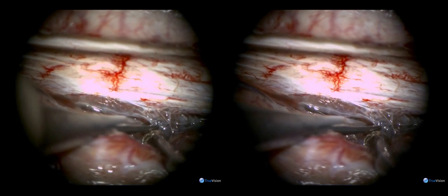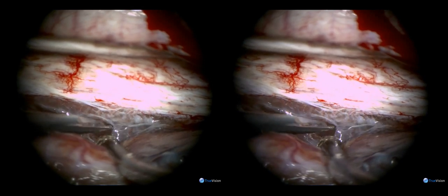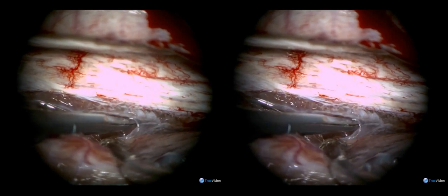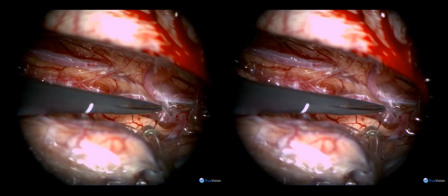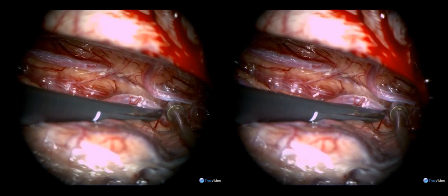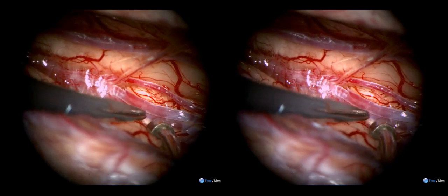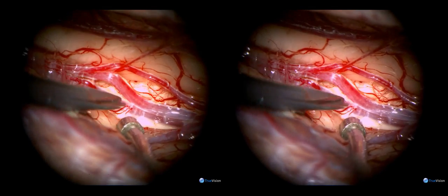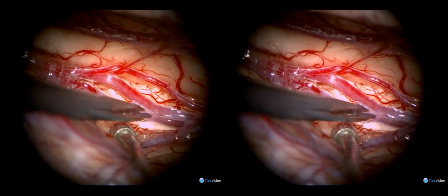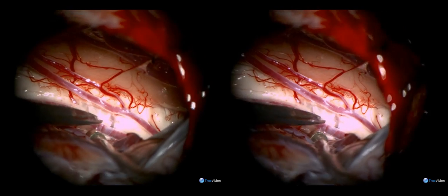This is the view down the falx to the cistern between the frontal lobes where we identify the callosomarginal arteries. As the arachnoid between the frontal lobes is separated, we get down to the pericallosal arteries and the corpus callosum. The corpus callosum has a glistening white appearance which distinguishes it from the cingulate gyrus.